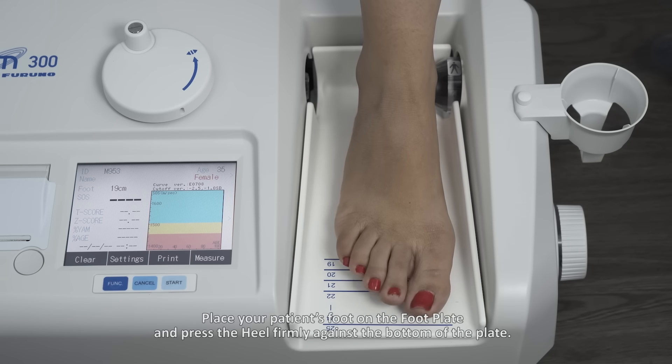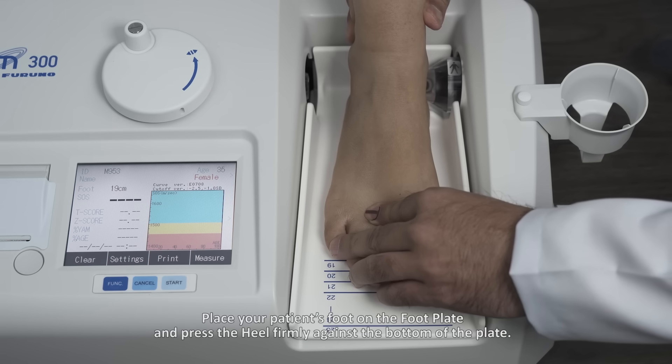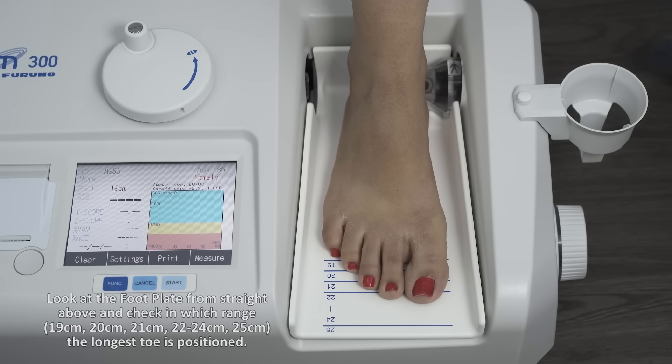Place your patient's foot on the footplate and press the heel firmly against the bottom of the plate. Look at the footplate from straight above and check in which range — 19 cm, 20 cm, 21 cm, 22 to 24 cm, or 25 cm — the longest toe is positioned.